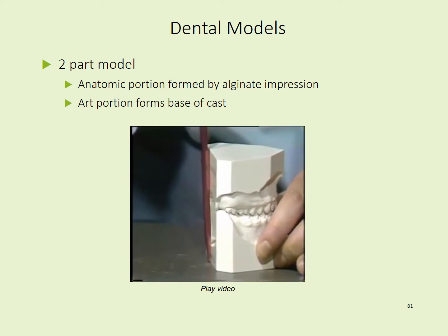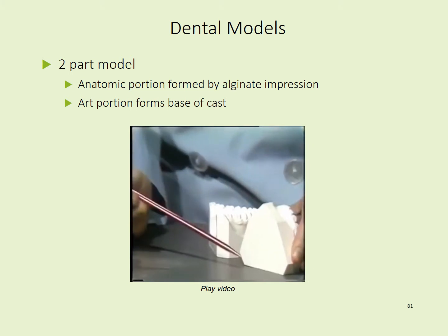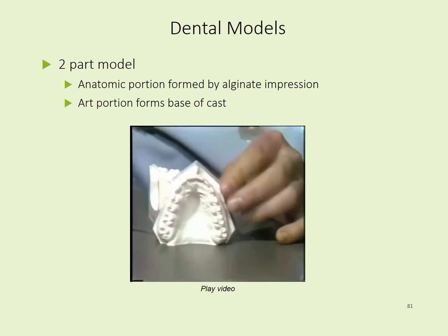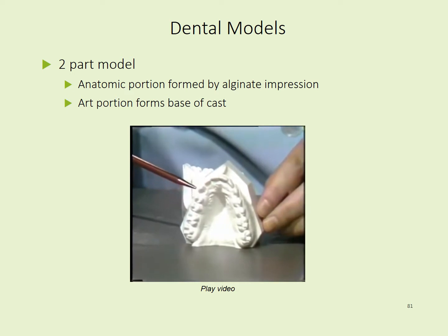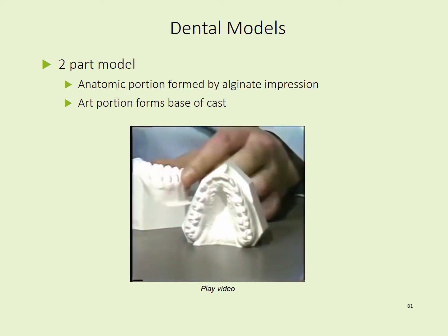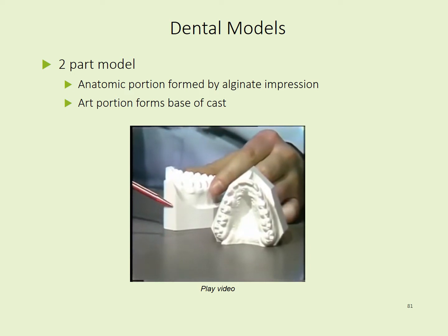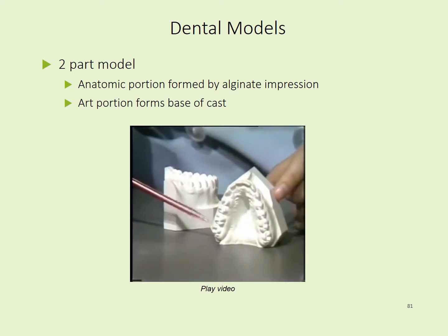The art portion of each cast is symmetrical, thus reflecting any asymmetry in the occlusion. The periphery of each cast is approximately equidistant from the facial surfaces of the teeth, and it is trimmed to the depth of the vestibule. All vertical line angles are parallel and perpendicular to the base. The heels are from 3/8 to 5/8 of an inch wide. They are equal from right to left, but not necessarily equal from upper to lower cast.